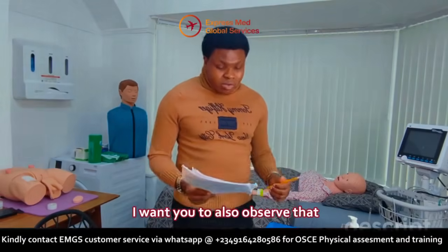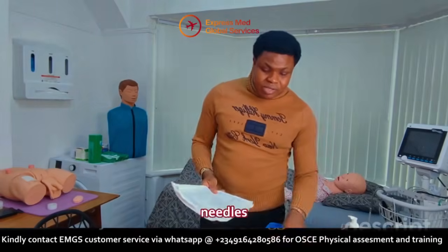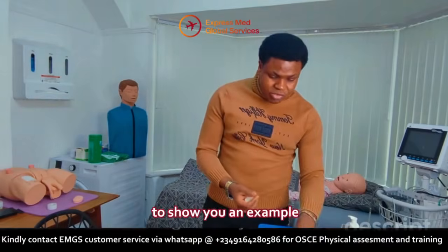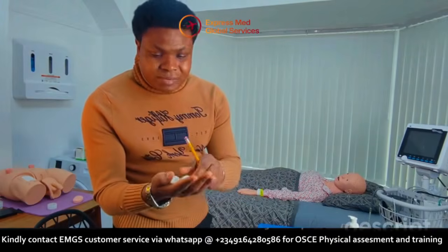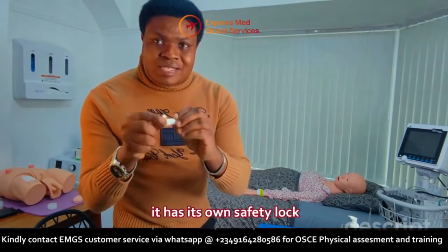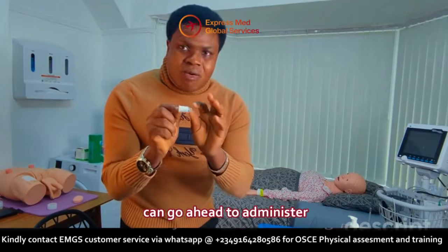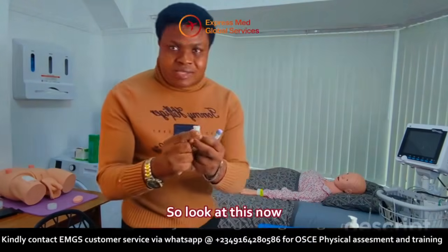I also want you to observe that in the course of this demonstration, there were different insulin needles. Let's start from the insulin needles. These are your insulin needles. I'm just picking this up to show you an example. There are 3 different types of needle right here. If you look at this very well, this is very, very advanced. This type of needle has its own safety lock. So before you go ahead to administer, let me quickly demonstrate with you. Look at this now.